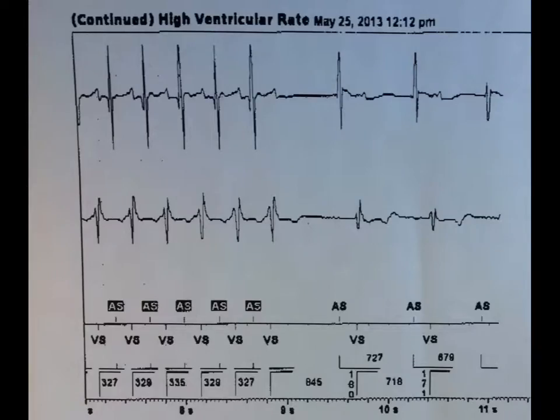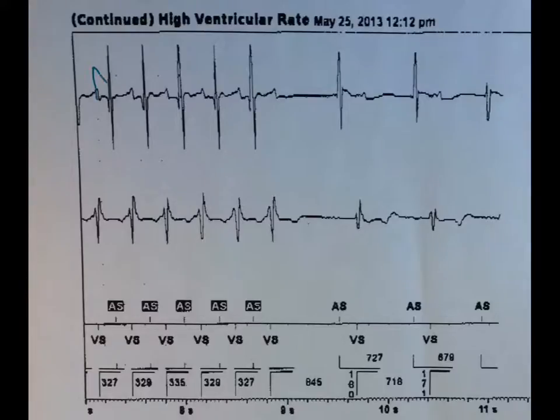Let's look at the next slide. This is the same arrhythmia, but it's a termination. How does it terminate? This is an A, these are V's, and it terminates with the last bit — the last electrogram is this one.